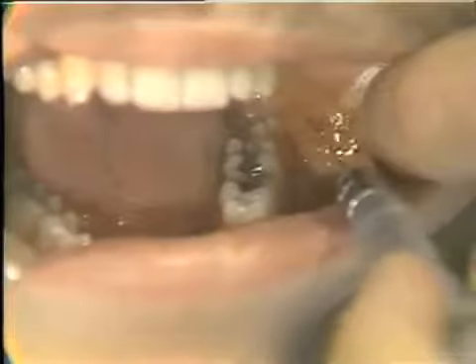And our approach with the syringe well out in the vestibule. And with these tight tissues, many times we can make our little puncture here without any discomfort, which we have accomplished now. And our needle bevel is truly only 3 or 4 millimeters below the surface of the mucosa. And now I'm going to aspirate to be sure that we're in a safe position, which we are.